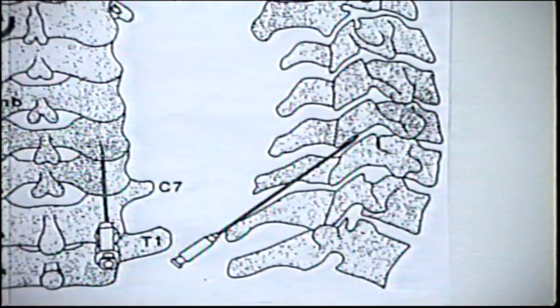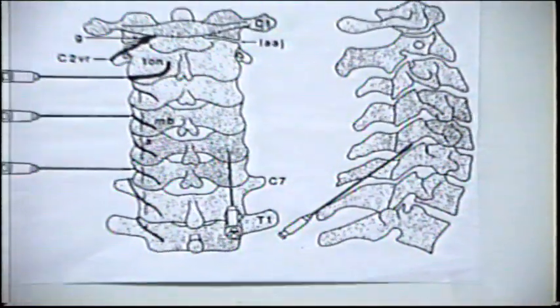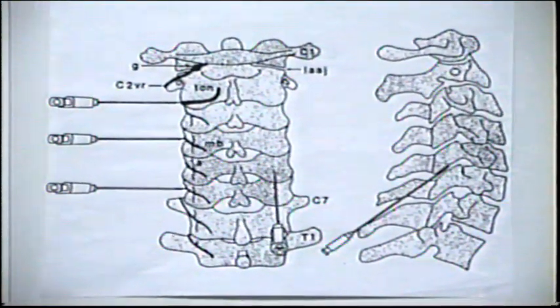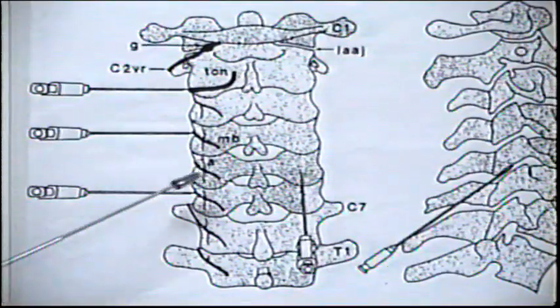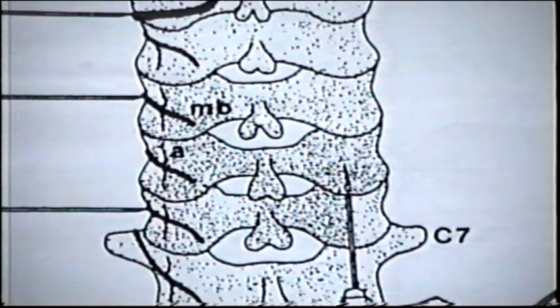So, this is practical points. Now, the blocks we are performing in the office consist of two stages. The initial stage of the block is the injection of the anesthetic solution. At this point, this is the diagnostic procedure.